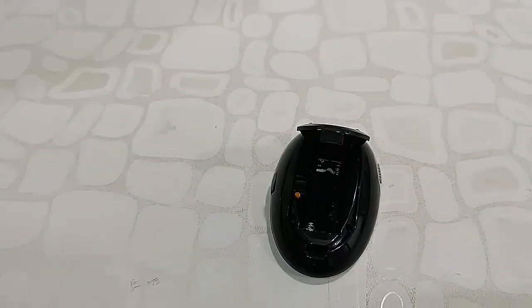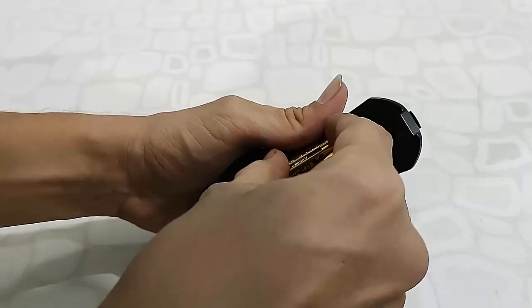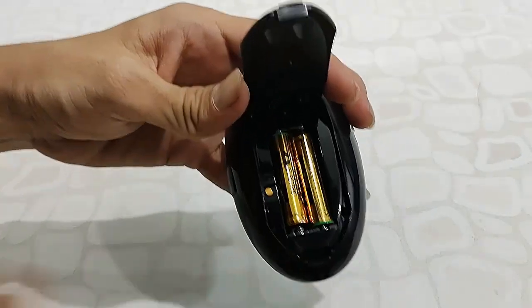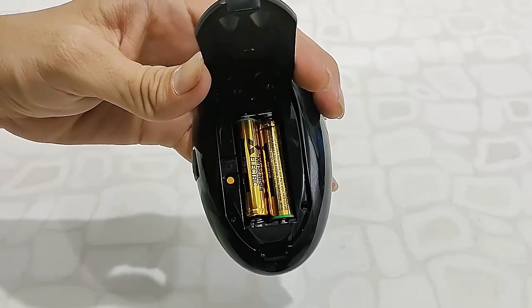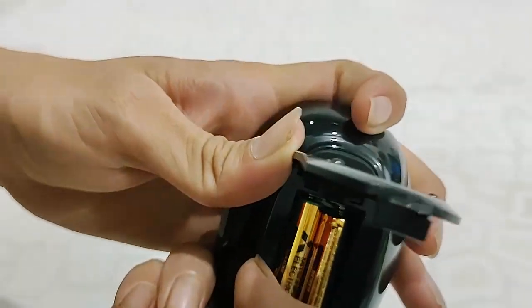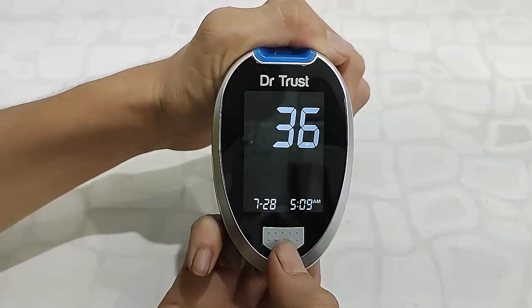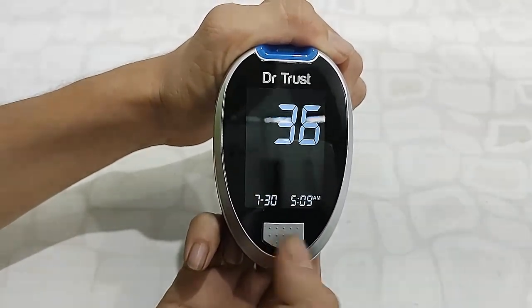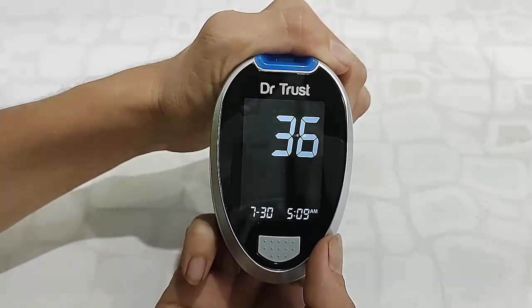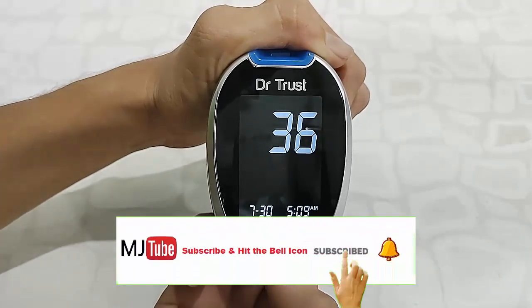You insert the two batteries into the battery compartment. Then press the settings button to configure the device. You can set the date, time, and hour format. You can also set alarms and reminders.